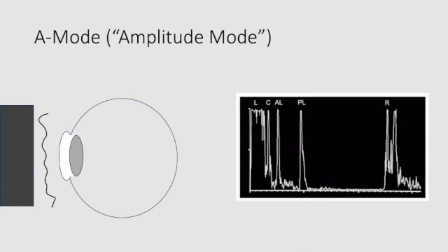So let's pretend that this is an eyeball, and I've drawn a little schema of that out here. This wiggly line on the far left represents our eyelid and the soft tissues of our eyelid. Here we have the front of our eye, our cornea, we have a lens here, vitreous, and then the back circle is the retina. While this isn't super detailed anatomically, it serves as a pretty good representation. If we look on the right, this side of the screen represents what an A mode output would look like if we were to send just one beam into the eye, which is what A mode does.